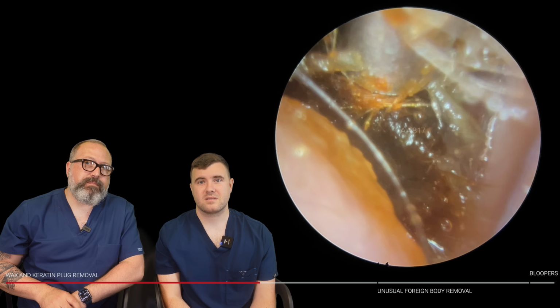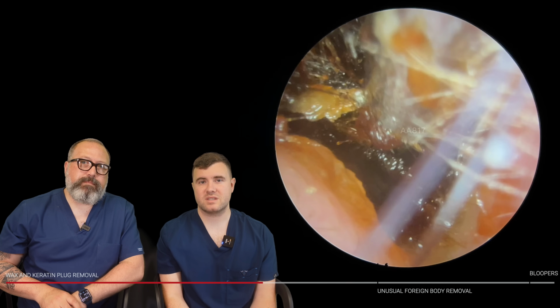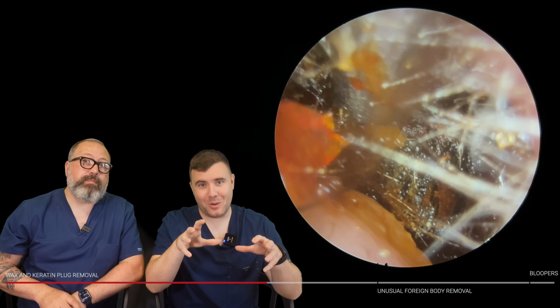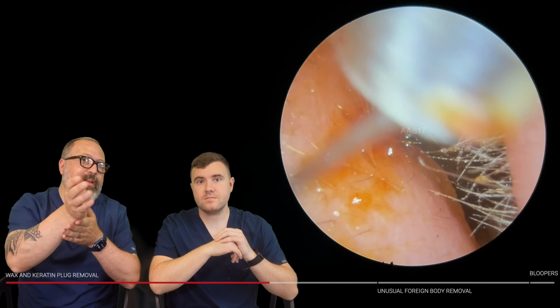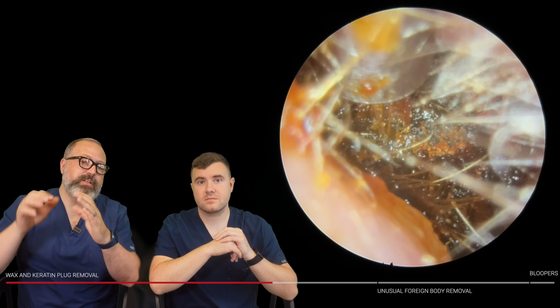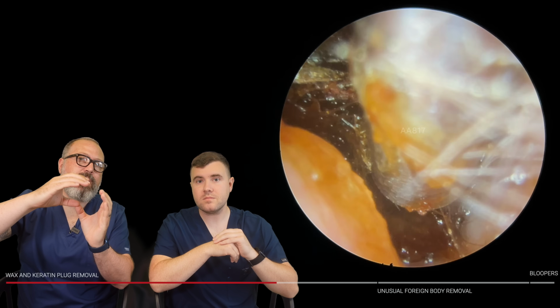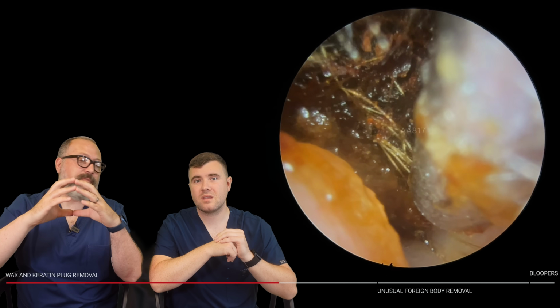Bit of olive oil's gone in. And the vision is not perfect either, because you've got a narrow ear canal, and you've got all the cilia. Luckily they're not long, so it's not completely blocking our view, but we've got a very pronounced first bend. It goes in at quite an angle straight away, and we've got this slight lump on the side of the canal wall there as well. So your ear canal ends up kidney bean shaped at the entrance. And beyond that it'll go back to a more rounded shape.